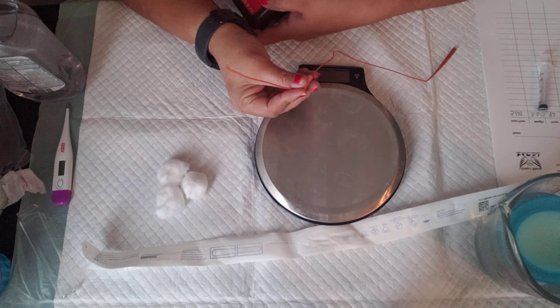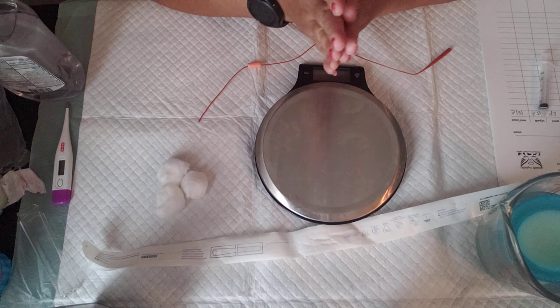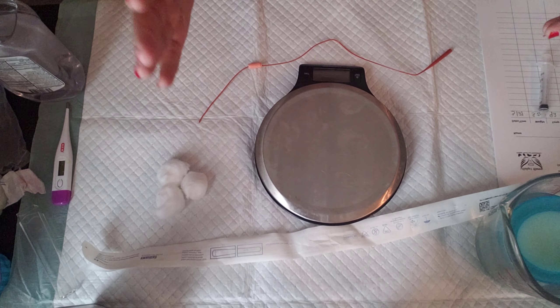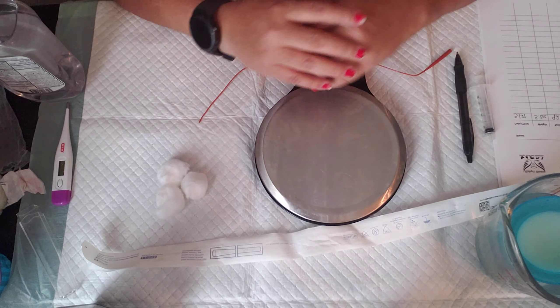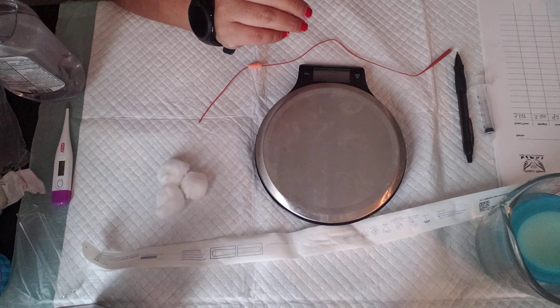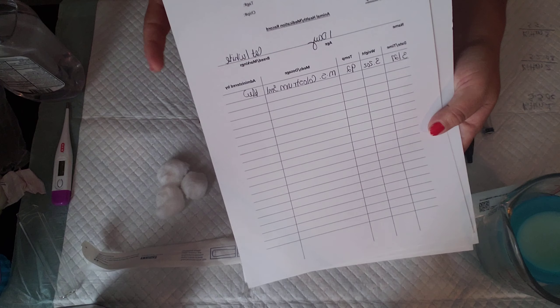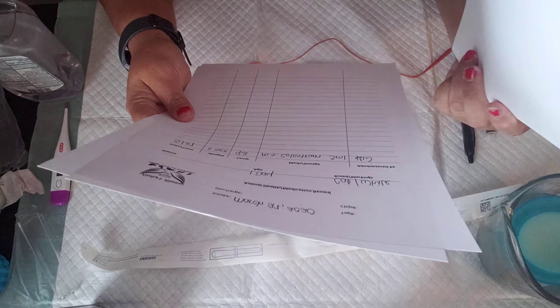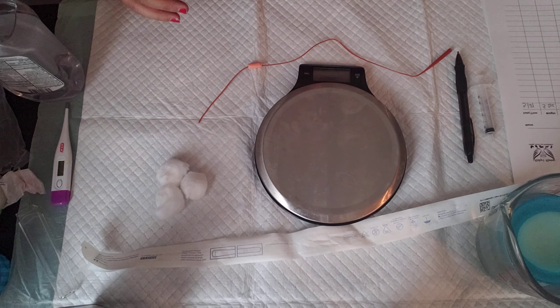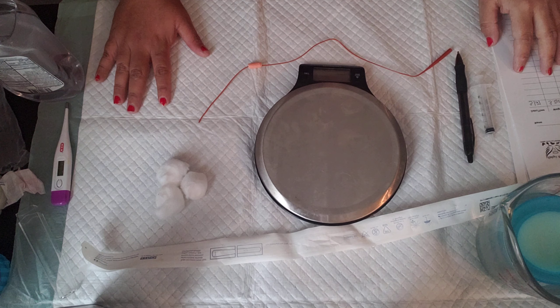Clean your supplies between feedings — you don't have to have more than one feeding tube. Always record how much they weigh and their temperature, all that good stuff. It helps with feeding time to know what to feed them. Clayton, can you hand me the first kitten?